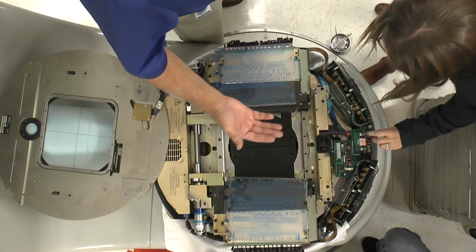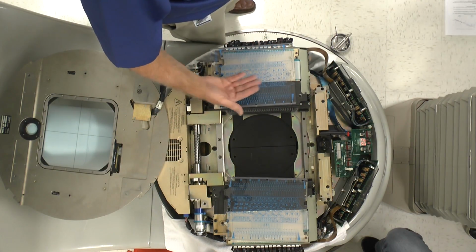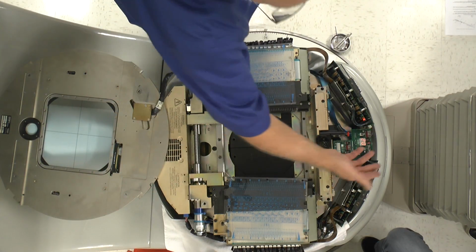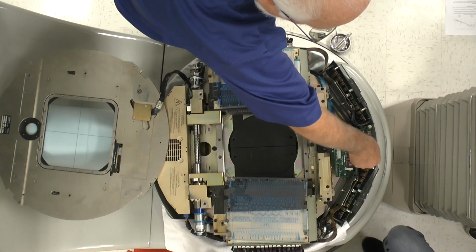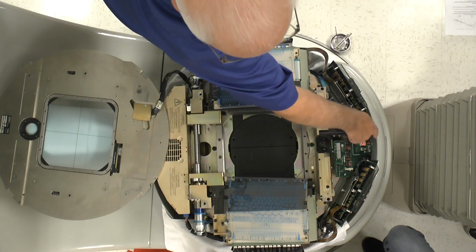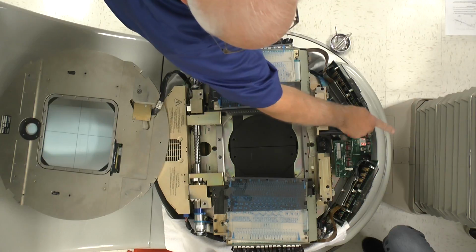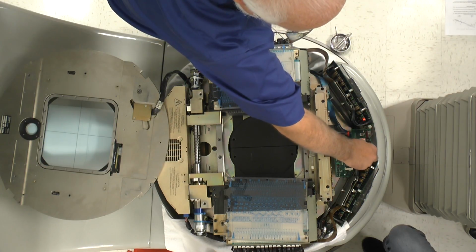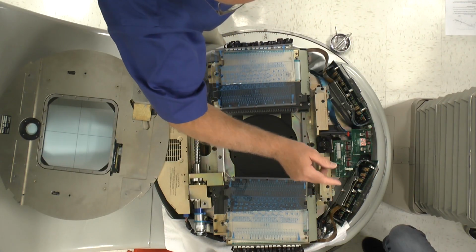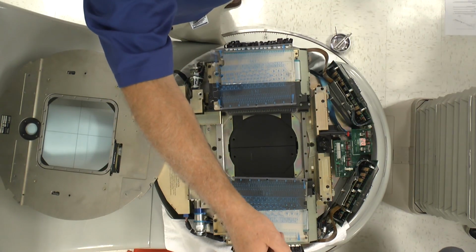Okay. So this is a 120 leaf MLC. You have 60 on each side. So how do you move the carriages? On this system, you go to 61, and that'll let you move the carriage. Okay, let's go with motor 6 and 6.